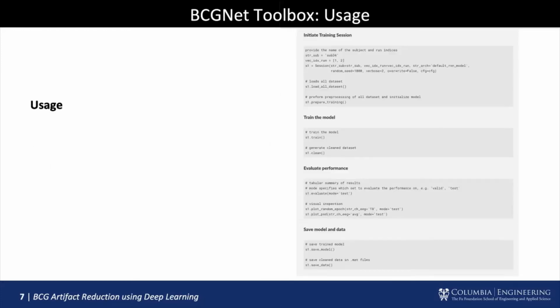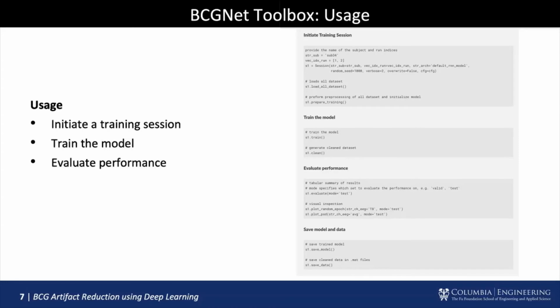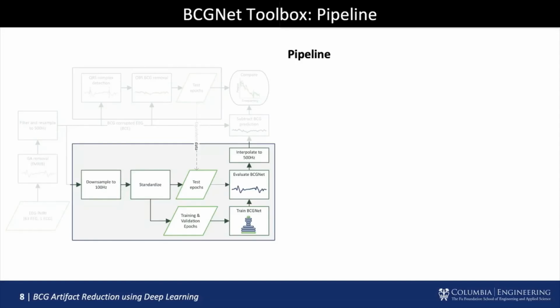BCGNet provides a simple and minimalistic user interface. To reduce the BCG artifacts in EEG signals, simply initialize the session, train the model, evaluate the performance, and save the cleaned data. Let's take a closer look into the internal pipeline.